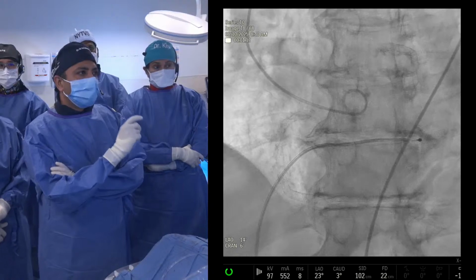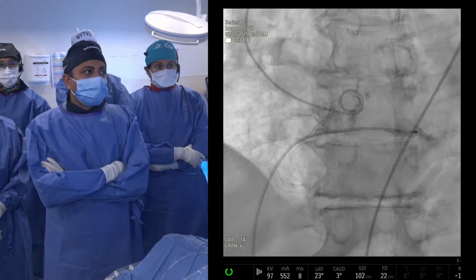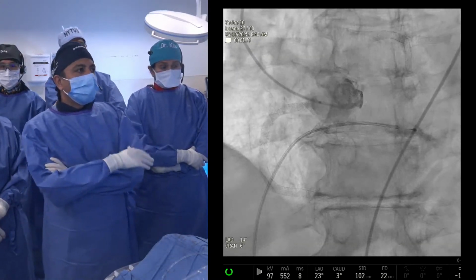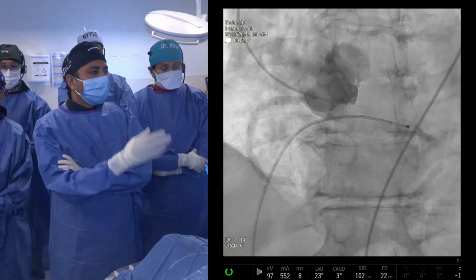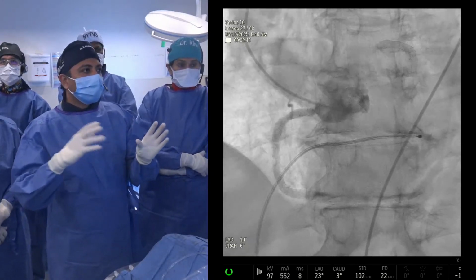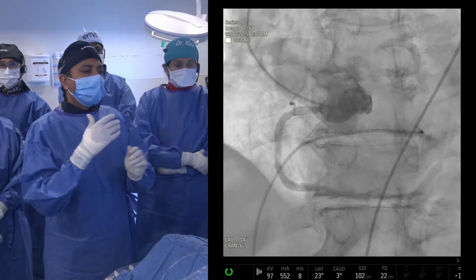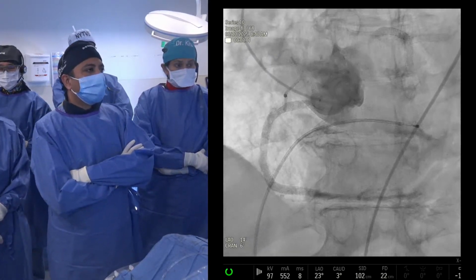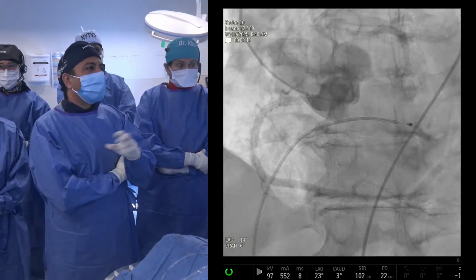Because we know that even if we do a 26 and we take the volume off, from our prior publications, where we have done either undersized or oversized with adding volume, it never actually comes up to what is expected for the frame expansion volume. And it's much more applicable for smaller sizes, 23 and 26. We have seen expansion almost getting to nominal in 29, but in 23 and 26, it's always smaller than what you expect. So if we end up with some PVL or any issues, then it might actually haunt him more. So I would probably choose this just because he's 84.